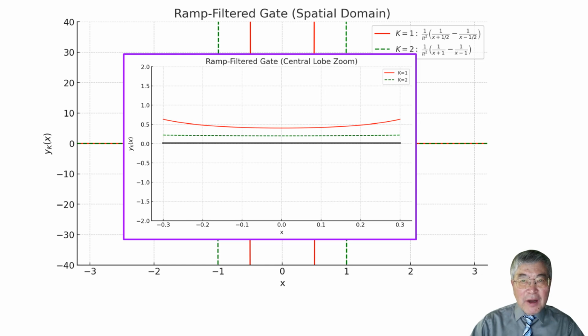So even though the object was magnified in the projection domain, after ramp filtering, the result is scaled down. This is why the correction factor must be placed in the denominator in the fan beam FBP formula. This slide gives a visual confirmation of the analysis. The ramp filtered fan beam response is smaller, and this reduction is exactly what we need to account for in the reconstruction formula.